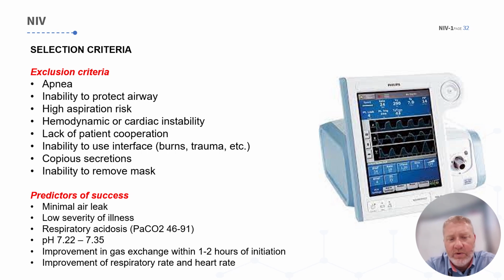So if you go to pick up a patient and they're already on BiPAP, take a look at the gas that they got, what the last gas was, and have in the back of your mind, okay, is it better than the previous one?